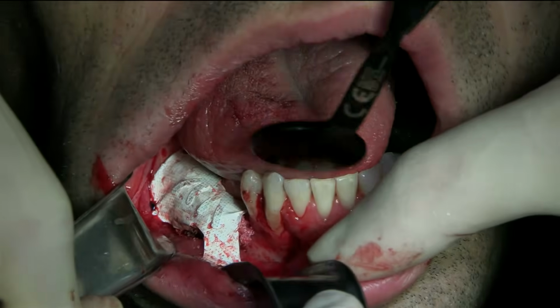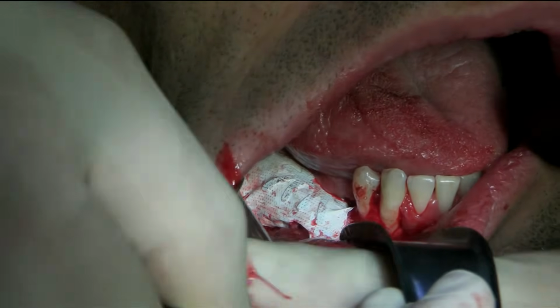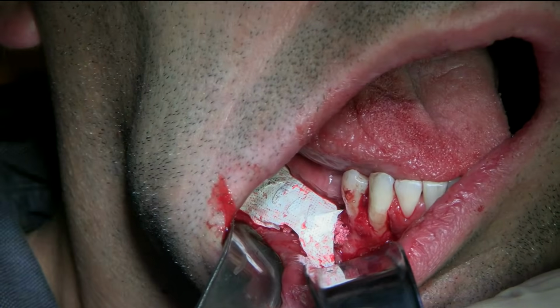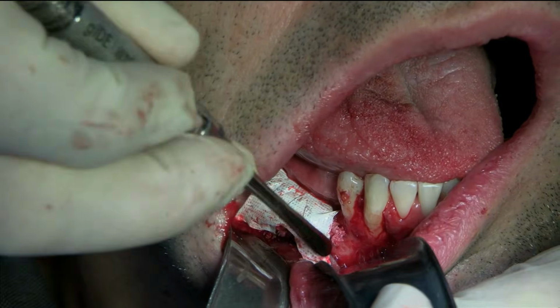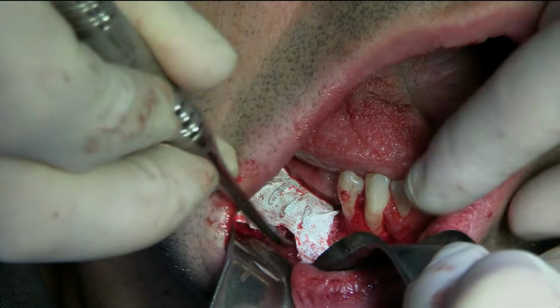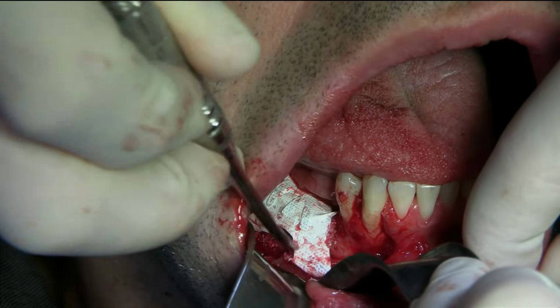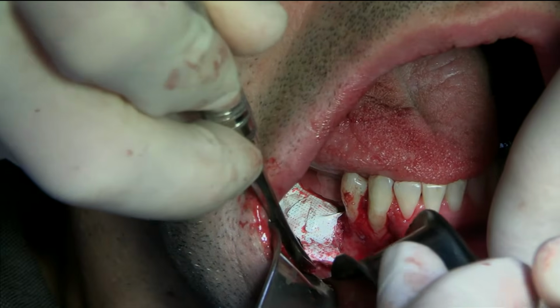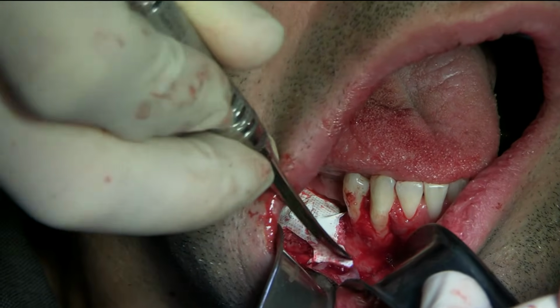Okay, a little bit to the left. Keep moving. Careful with the mental. Where's the mental?